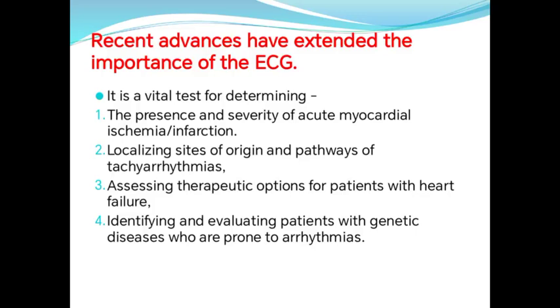Okay, and many other problems we can diagnose with the ECG, and we can also use the ECG to monitor the heart. This is one part of the vital signs of the heart, by calculating the heart rate. If you go into the ICU, you see the monitor that contains the ECG waves. This monitor is used to monitor the vital signs of patients and the patient's general condition in the intensive care unit or in the operating room. And there are a lot of other uses of the ECG in medicine.